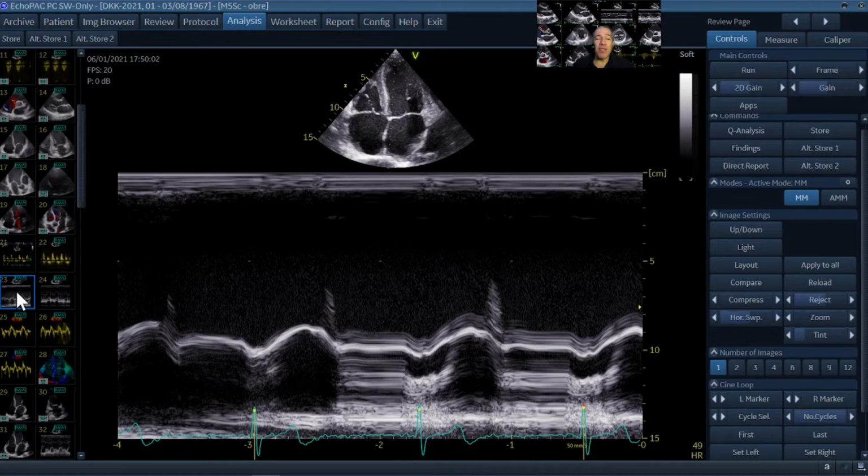I did this here in this recording with an original M-mode, the one that you saw before. It's a kind of post-processing of the 2D image, but here this is a true M-mode. And what you now see here is that we pick up the motion of this atrioventricular plane, and this is picked up here. So this is the motion of the atrioventricular plane.